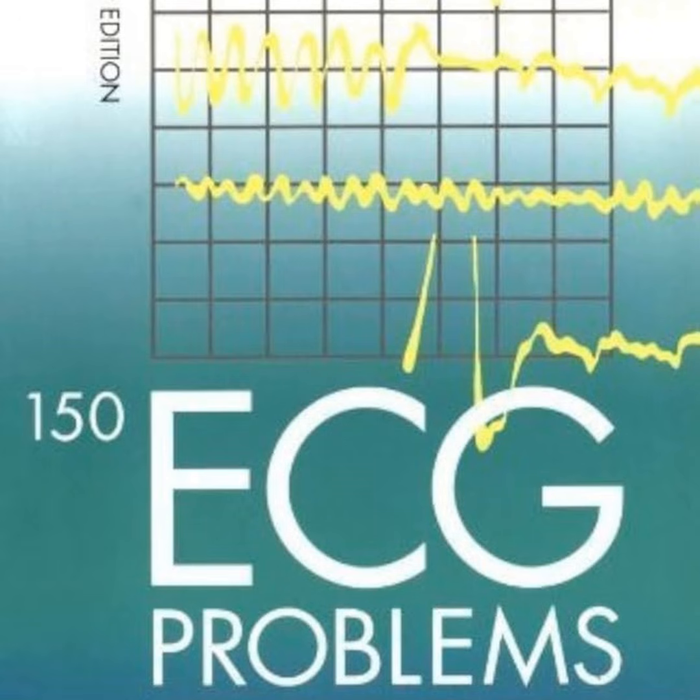It really did. Now, let's contrast that external pharmacological poisoning with an internal, just catastrophic failure of the electrical wiring itself. Okay. Consider a patient who presents after a sudden, completely unprovoked syncopal episode, and they sustain a fall. You run the ECG, and you see complete atrioventricular dissociation. So complete heart block. Yeah. The P waves are firing at a normal intrinsic rate, let's say 70 beats per minute. But the QRS complexes are completely divorced from them. They're firing at this slow, wide 45 beats per minute.